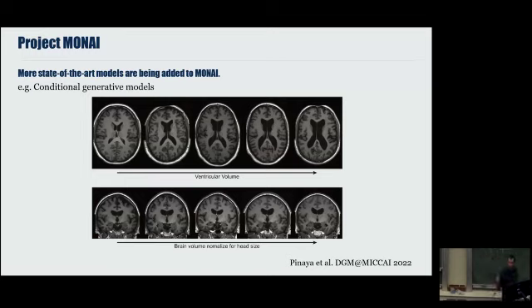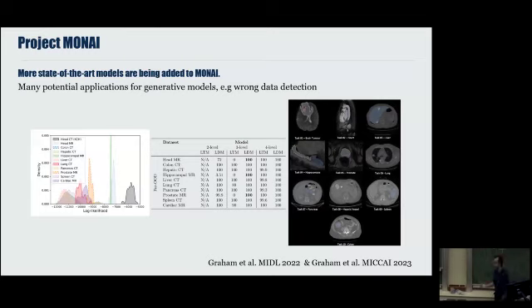So we are able to start playing and generating a lot of data, like we are already doing in computer vision, where we can generate a photograph of anything we'd like, just with the right token. We are now able to do the same on volumetric images in 3D. And then we can use these tools as an exemplar to do outlier detection or far out of sample detection. Let's not go into detail about the table, but what it shows is that we've got two types of generative model, one based on latent transformers, the other based on a diffusion model.